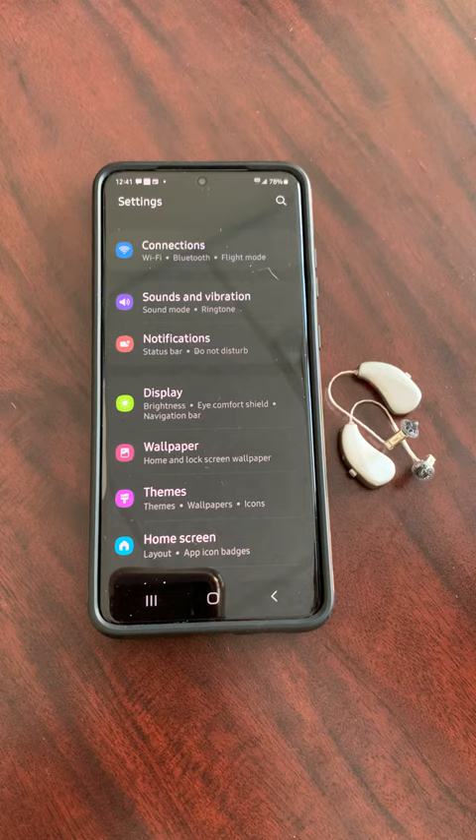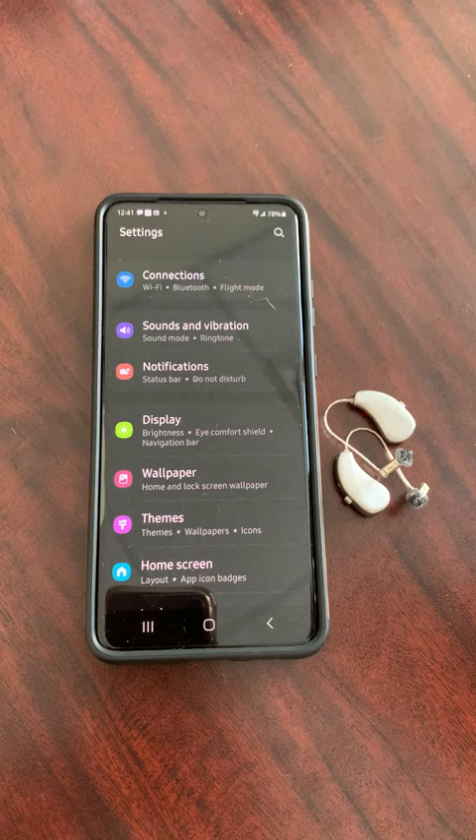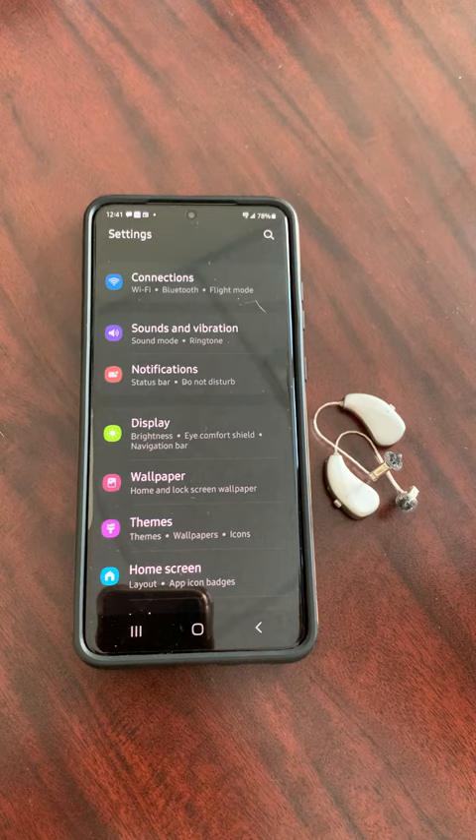Today's vlog is going to explain how to connect hearing aids directly to an Android phone. We've done a video on how to connect to an iPhone, but now more and more Android phones are compatible for direct connectivity.